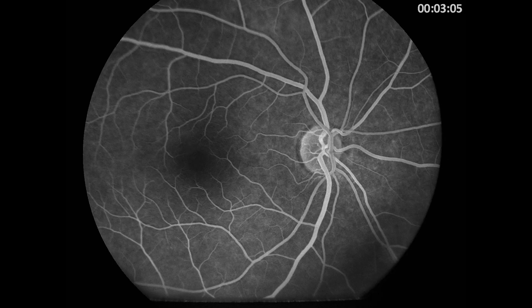In the late phase, the doctor will interpret evacuation of dye from the retina and vessels. This complete procedure is helpful in interpreting AMD for any central vision loss and planning a laser treatment for DR patients.